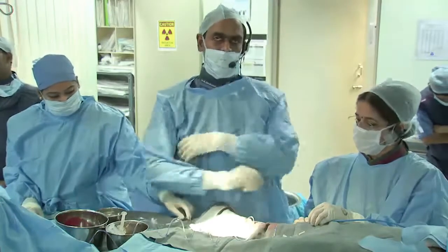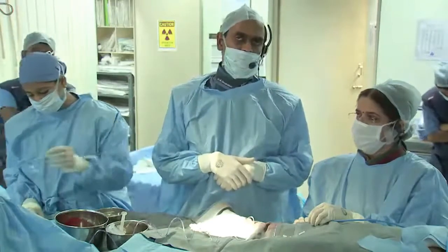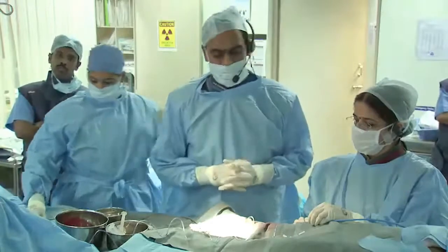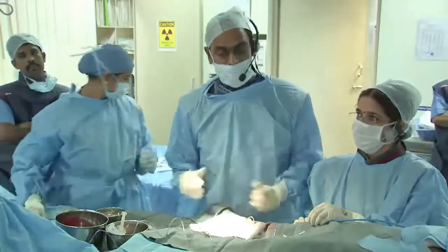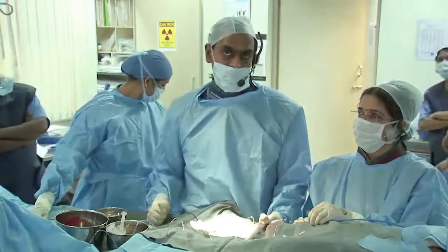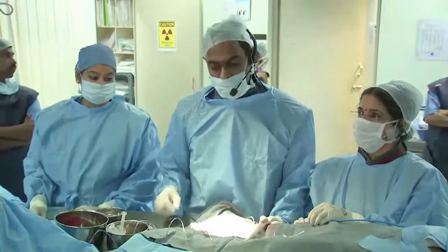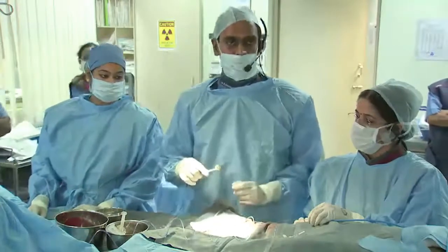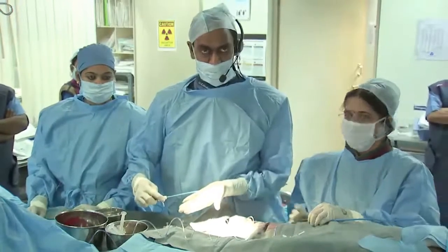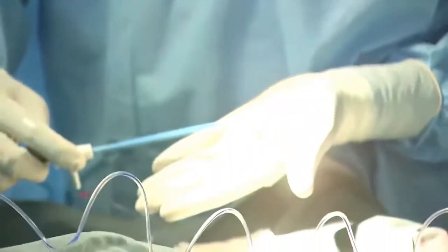However, if the whole event is going to happen at some remote area, then we will not have access to this patient. This patient is actually coming from South Africa. He's a Sri Lankan who is living in South Africa and who is coming to India for treatment. So I thought a lot, and I decided that I will go ahead with the original plan of putting in a 5 millimeter. So now let me show you the picture, zoom in here, zoom in.